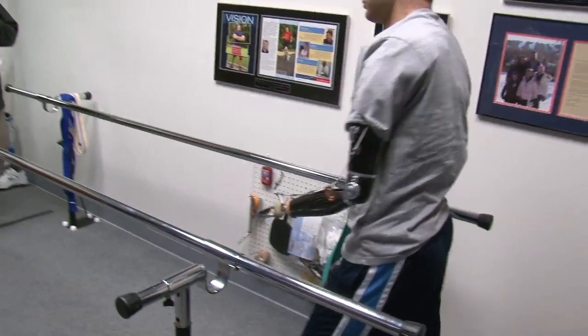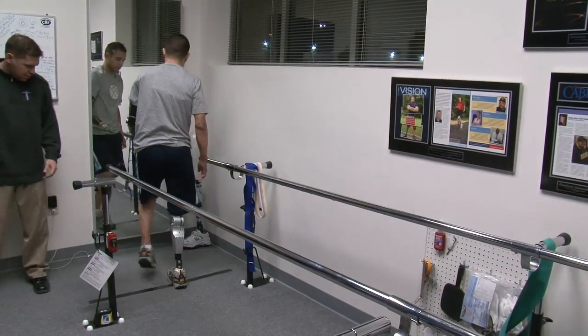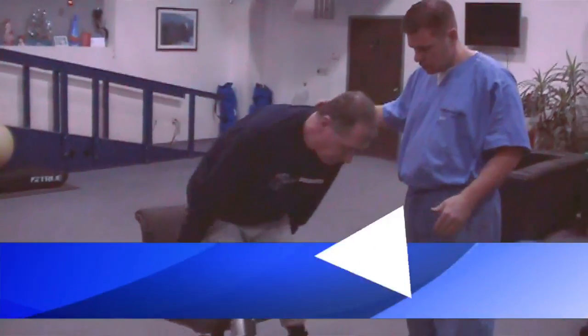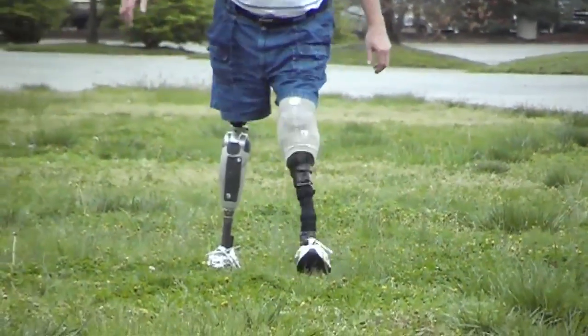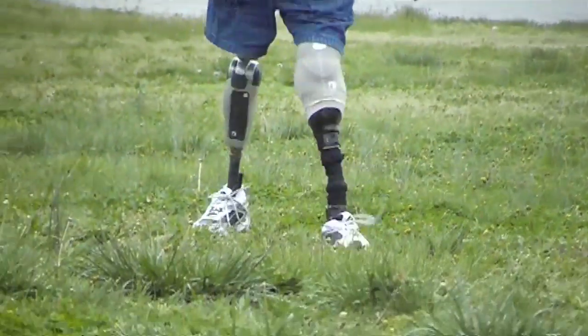With powered prosthetics, there's a knee here called the Power Knee 2 that actually restores power. This individual who wears this is a bilateral above-knee amputee — it actually powers them up out of a chair. With microprocessor knees he could walk a quarter mile without stopping, but with the Power Knee he can do over a mile without stopping.